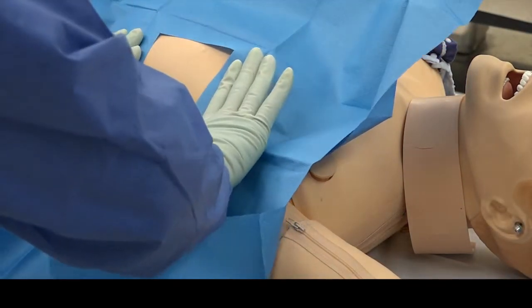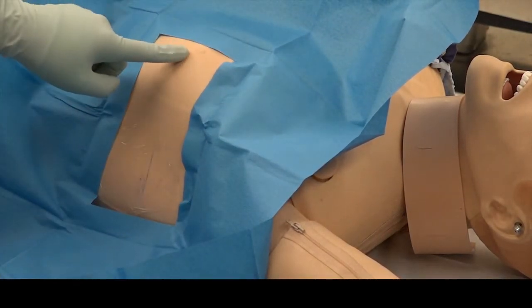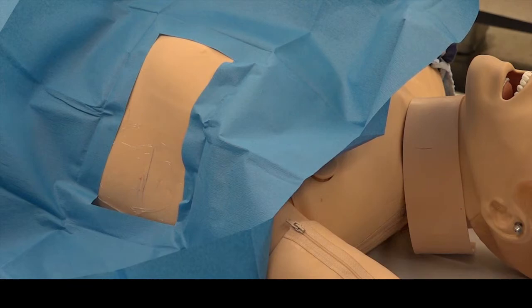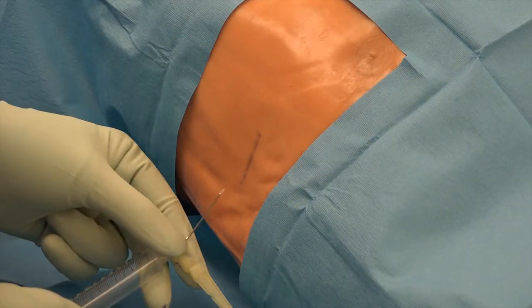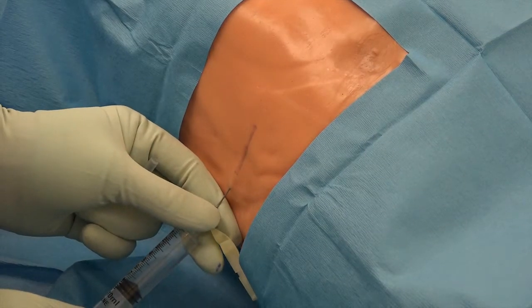Take care to expose the nipple in males and the inferior mammary fold in female patients to act as an anatomic landmark. Now anesthetize the skin and subcutaneous fat with a local anesthetic, for example 1% lidocaine with epinephrine.